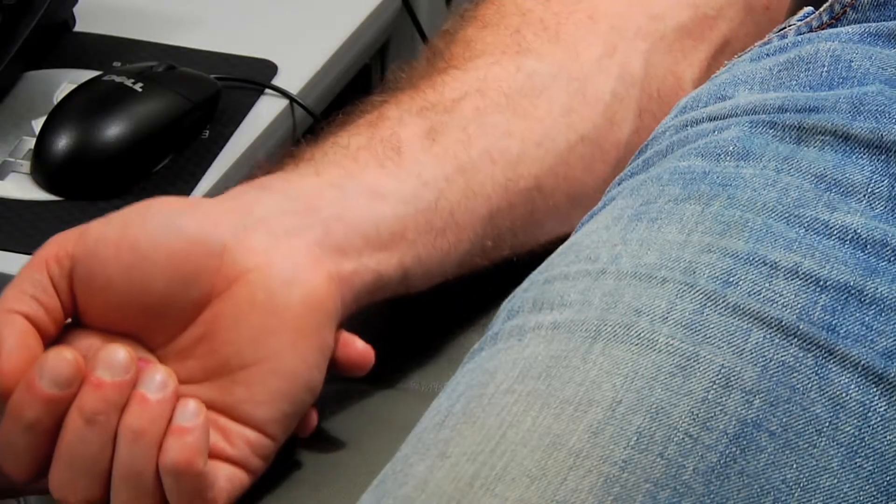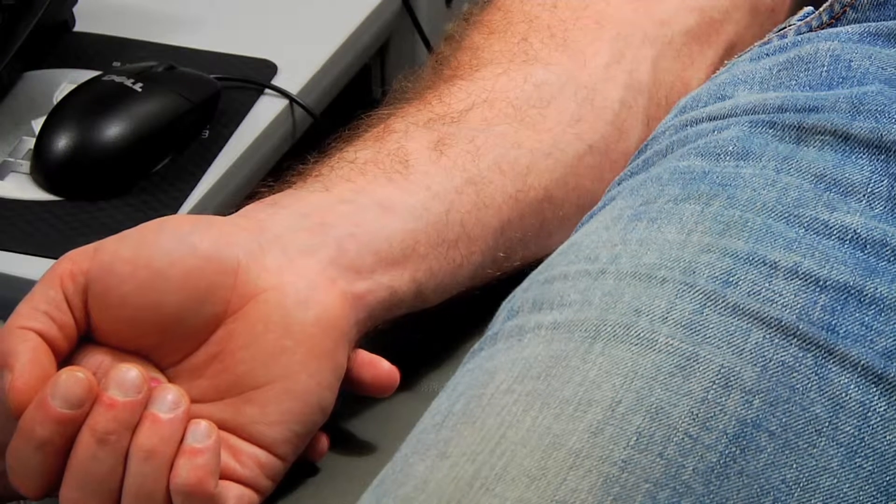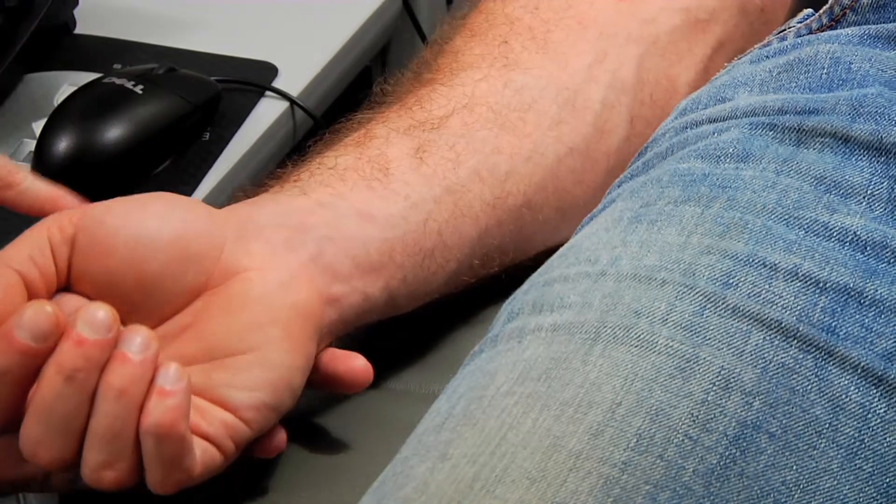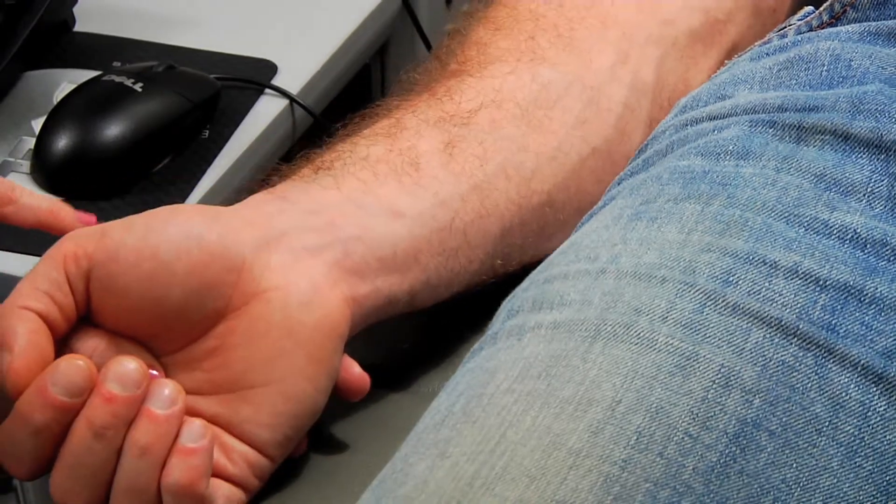This is a really helpful move if you're having trouble getting anyone's pulse, but especially someone who has a faint pulse, because that's going to bring it to the surface rather than it being embedded down. It brings it right up there.